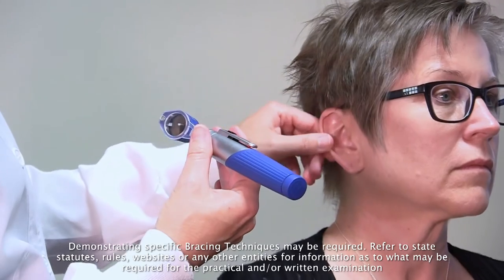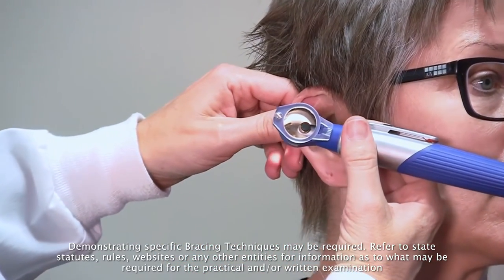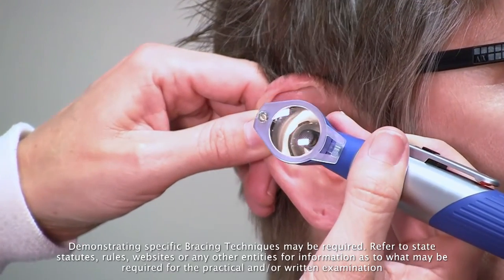That's loud. First, grabbing the pinna to straighten the canal, and then placing the pinky and the ring finger on the face against the cheek to brace in case the patient moves.